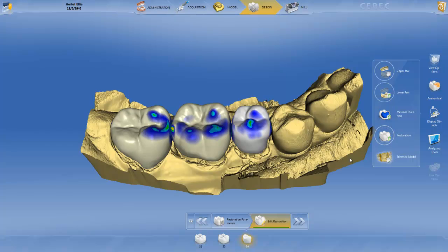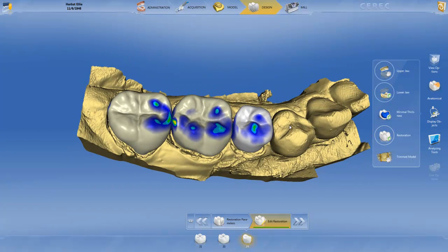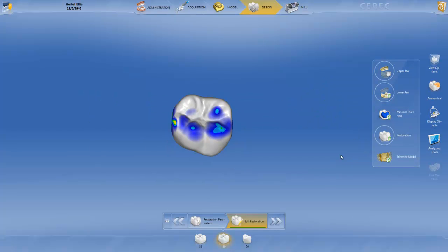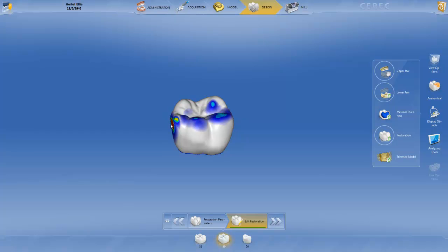Okay, it's great. Let's go on number 30. Contact is great. Just a little bit of adjustment here.